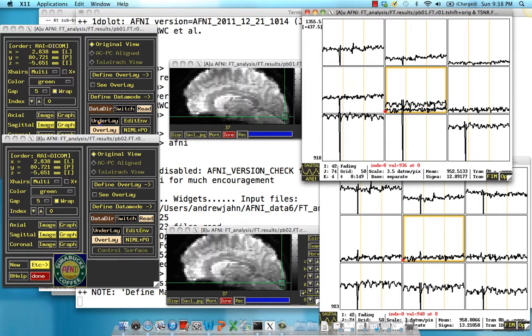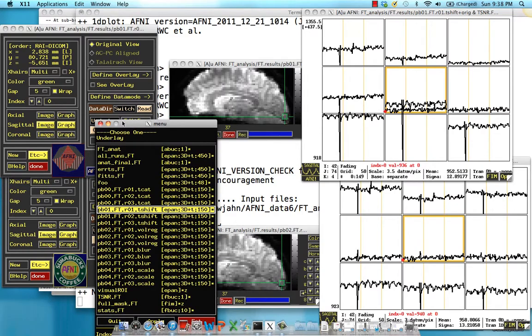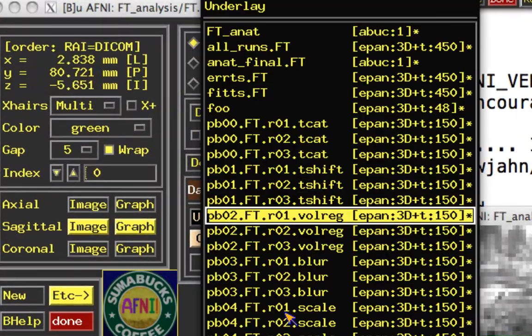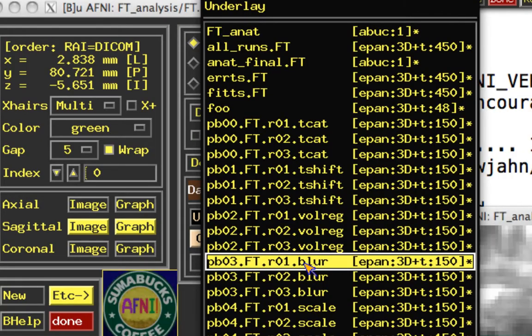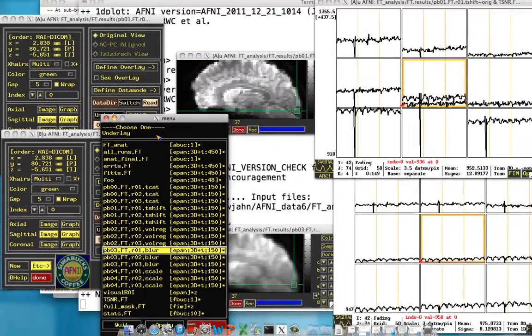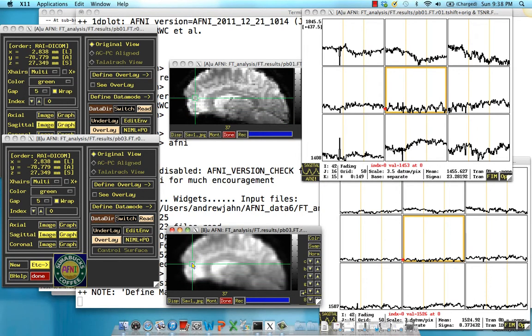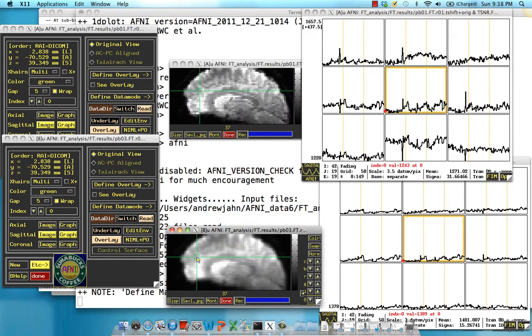To show you this, let's open up the smooth dataset in this lower panel right here — R01 blur. Notice the first thing is that it's blurrier. It's a little bit grainier. It's a little bit lower resolution. That's because we've averaged a bunch of signal around the surrounding voxel.